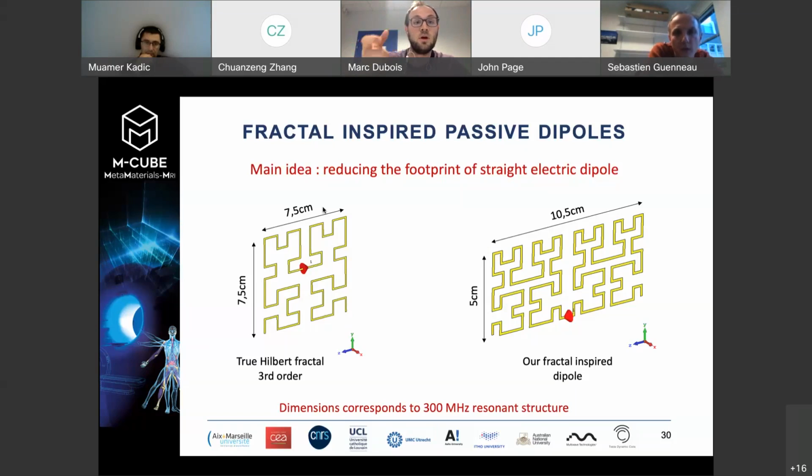It's not the RF coil that gets switched on and off, but what's making the sound is clack, clack, clack, clack. So very, very diverse sound. If it was mono-frequency like the RF, I'm pretty sure an acoustic metamaterial could be nice. But since it is very broad, it requires really cutting-edge metamaterial proofing, because we are talking about maybe 2 or 3 decades of sound frequencies.